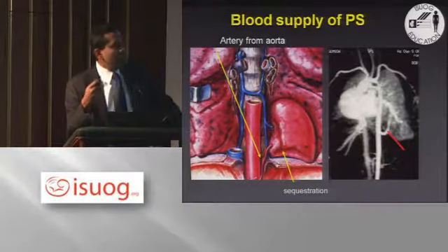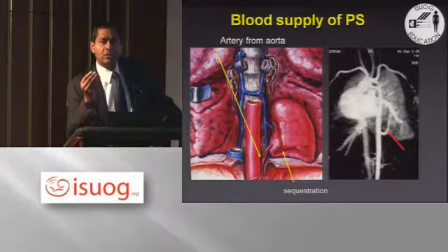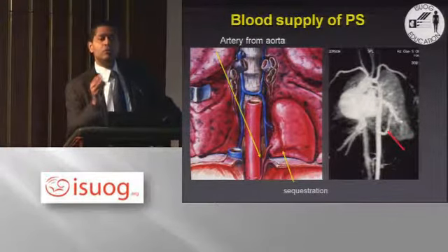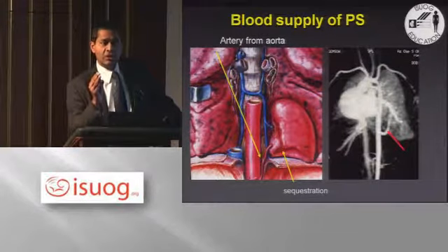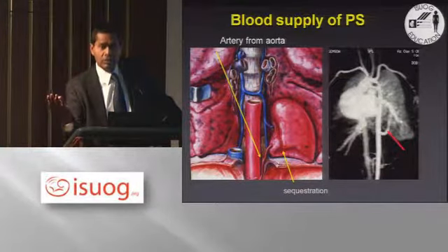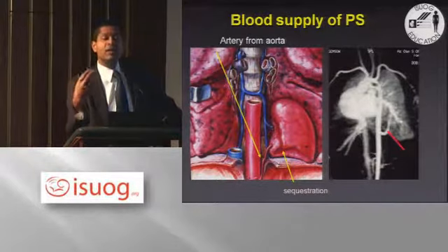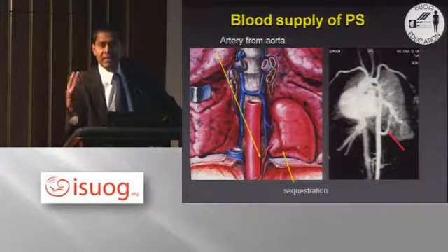And that's the main reason we have turned away from a prenatal diagnosis of CCAM or a prenatal diagnosis of pulmonary sequestration, and typify these lesions as echogenic lung lesions. Try not to be specific as to whether it's a CCAM or a pulmonary sequestration. If you see an independent blood supply, say this is an echogenic lung lesion with a significant pulmonary sequestration component. If you see an echogenic lung lesion with very large cysts in it, then this is an echogenic lung lesion with a predominantly CCAM component. Does that make sense? Absolutely.